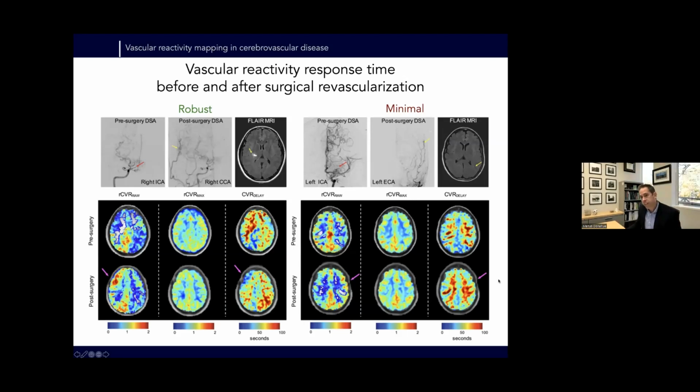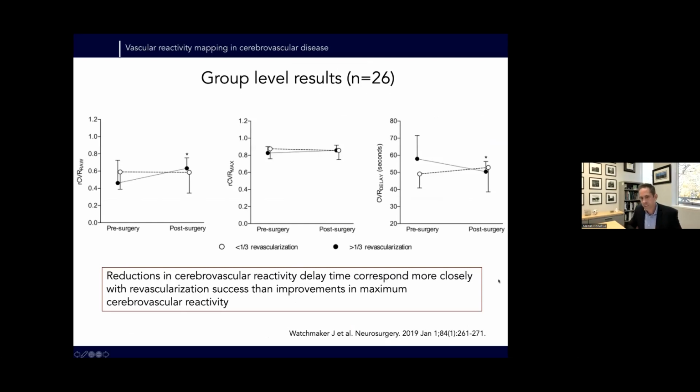And that's nice because you can't really do surveillance angiograms in these patients, right? You have to inject contrast. There's a risk of stroke. So you give a non-invasive way of monitoring these patients.